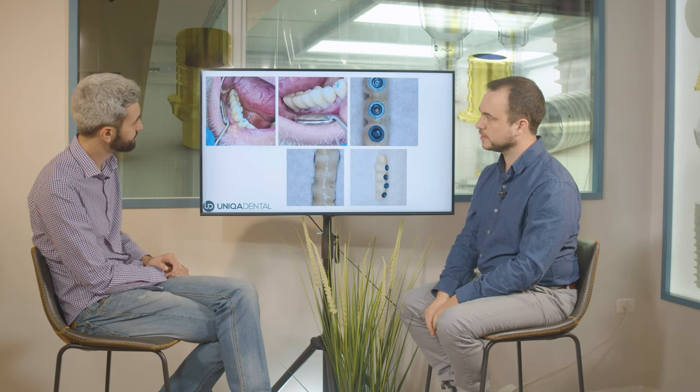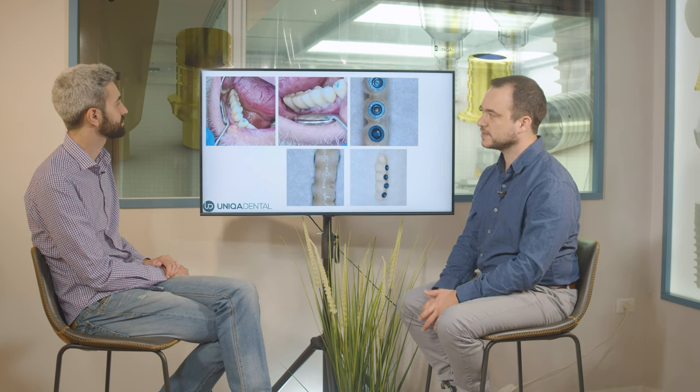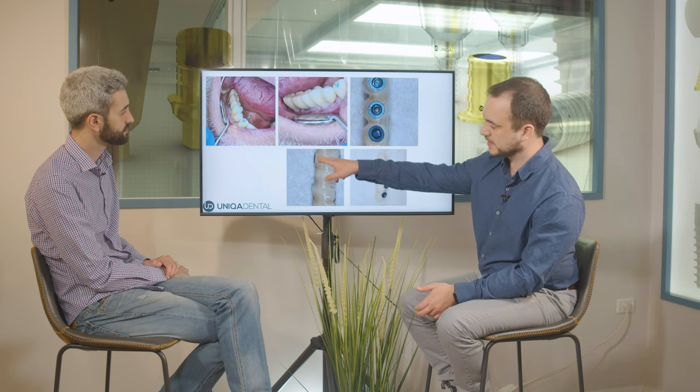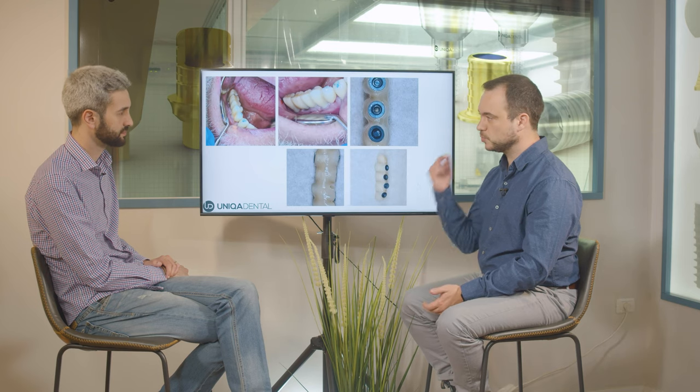This is the occlusal check. You can see contacts on all of the crowns. All of the sleeves are inside the bridge with no cement residues. We also took a little bit of material between the sleeves so the patient will have a little bit of space to clean between the implants.